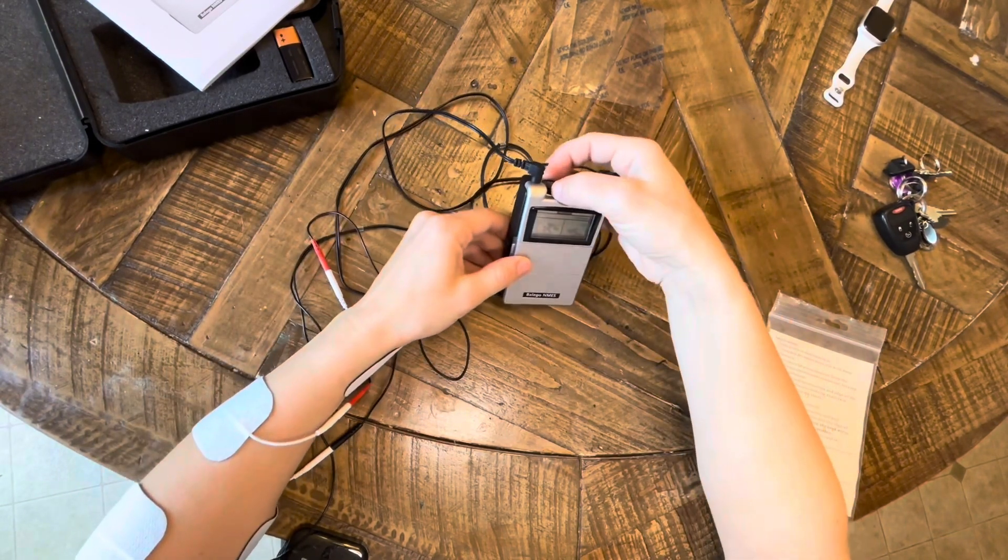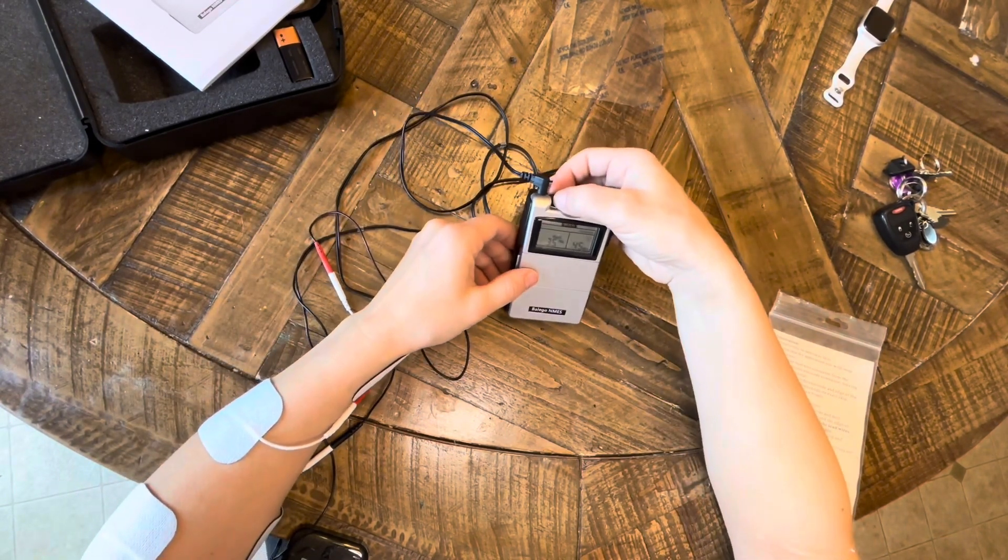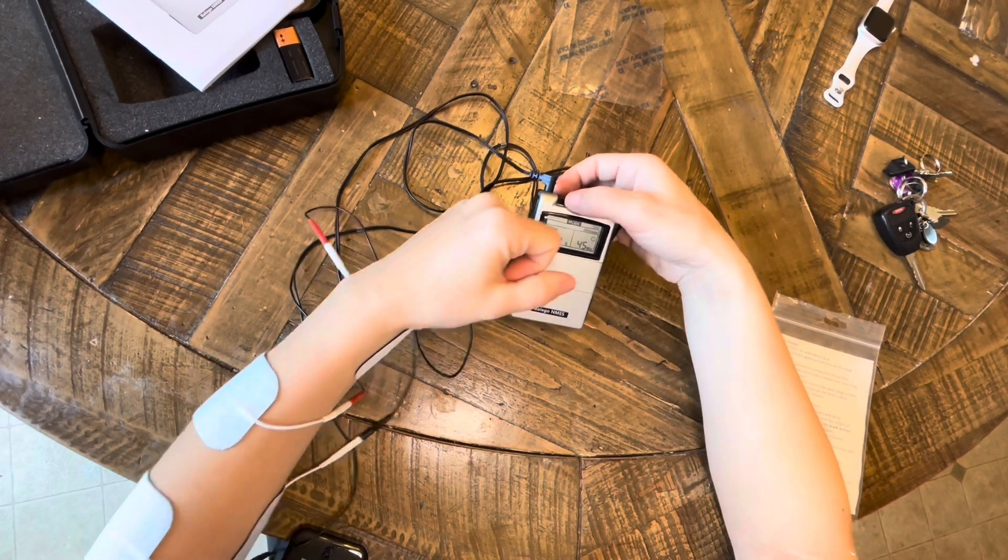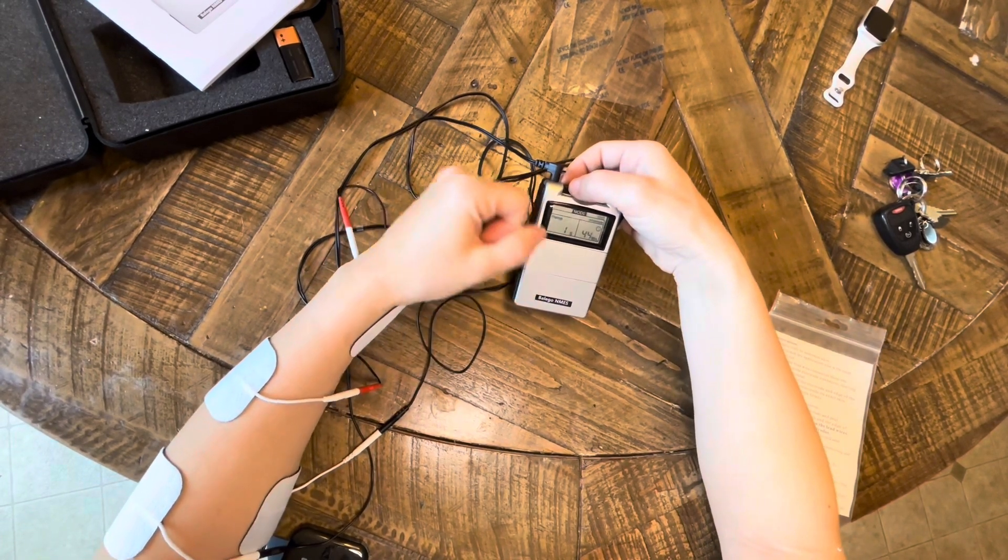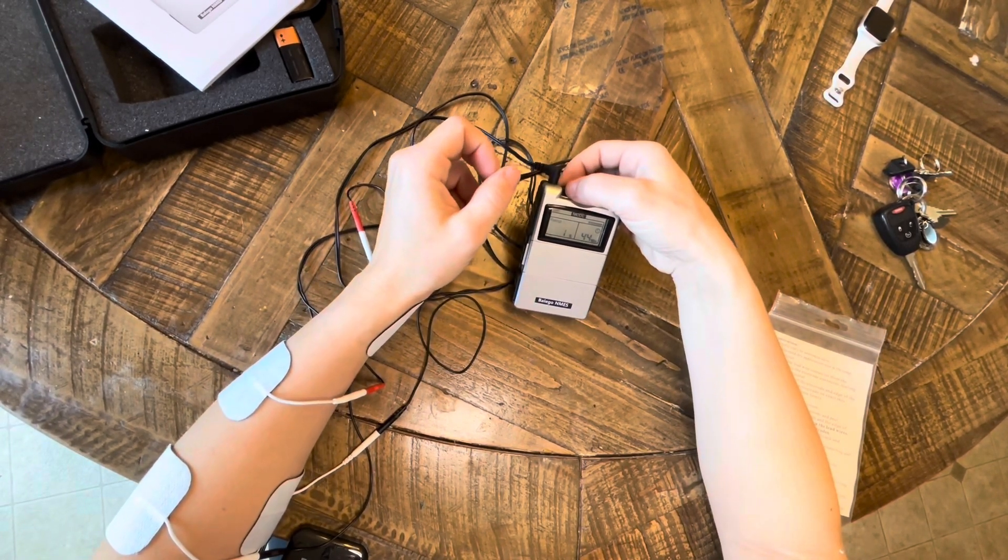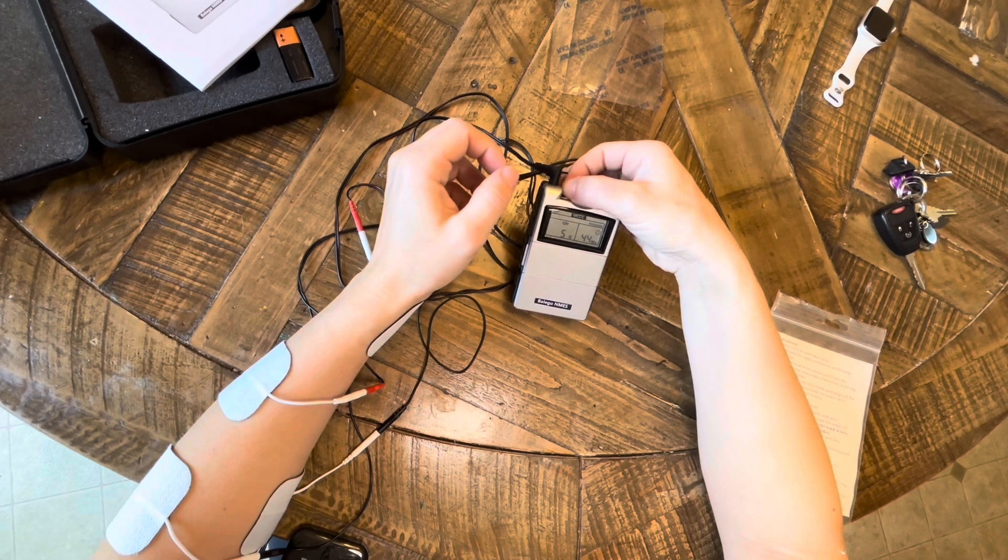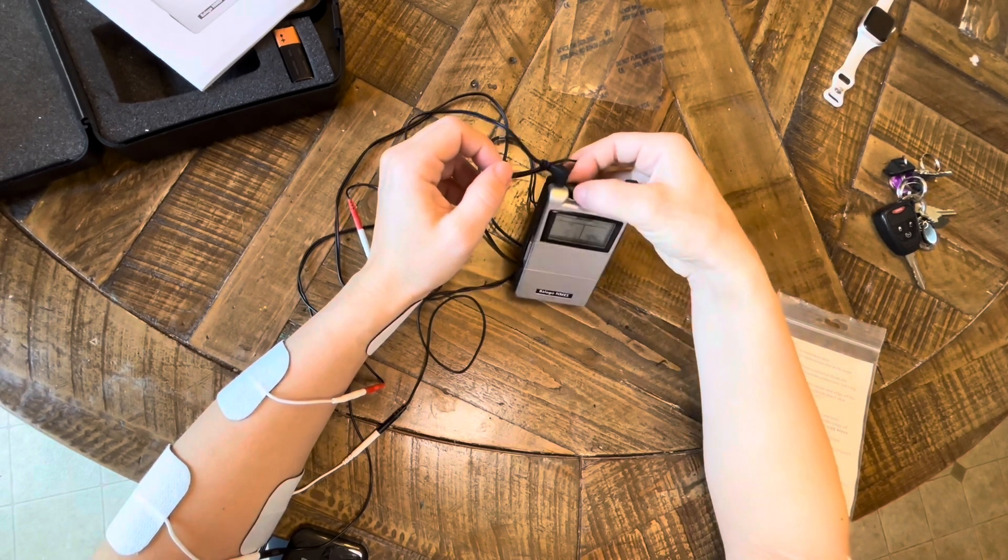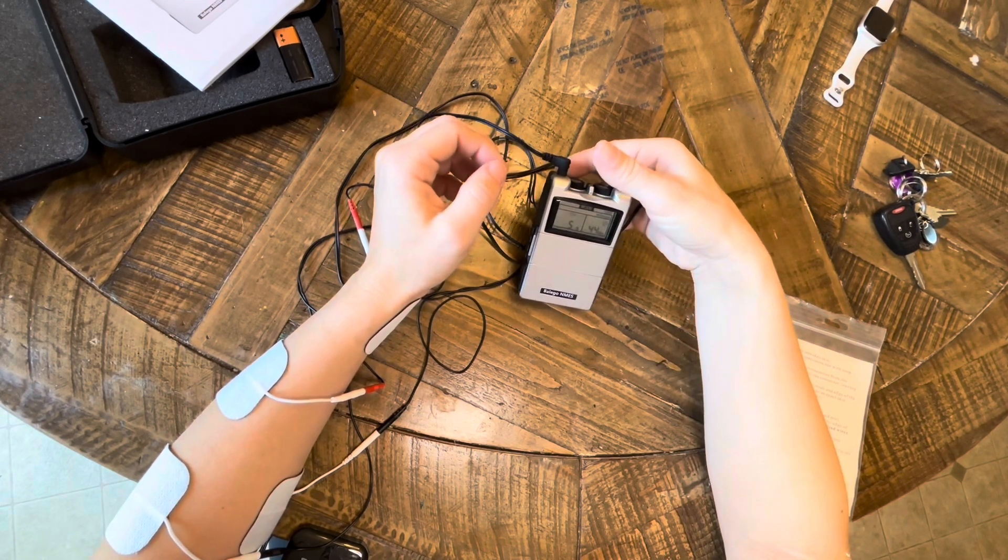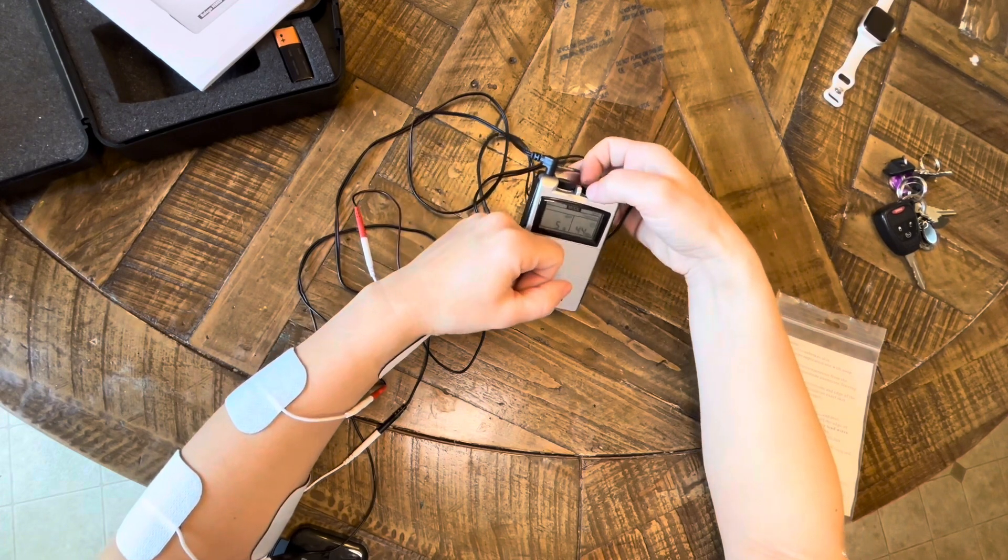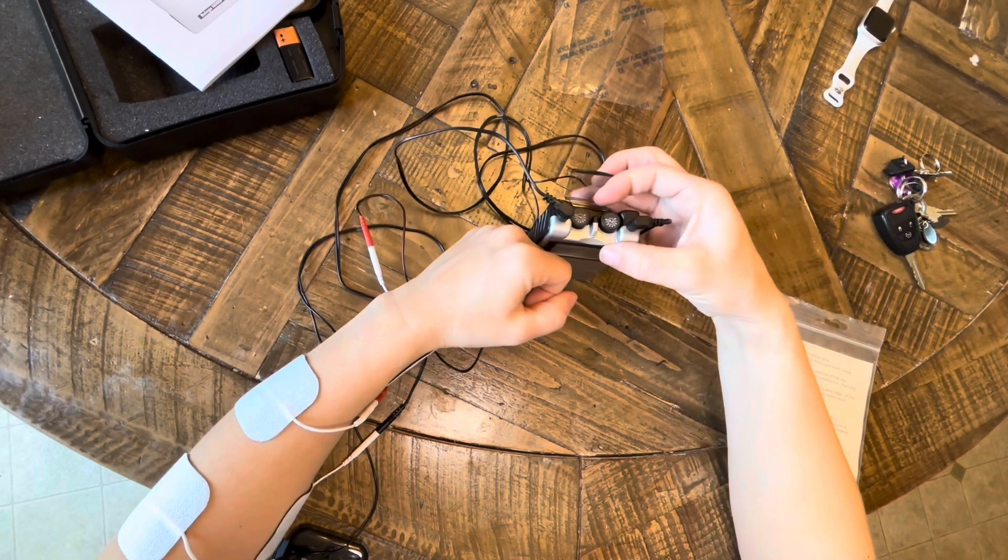Just a little bit of turning the dial can have a significant effect, so make sure that you're going slow, especially when you get to a point where the patient can actually feel the stim. Just a little bit more and you should be able to get the muscle contraction.